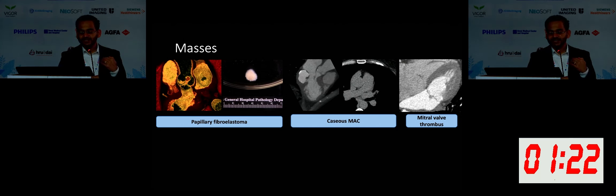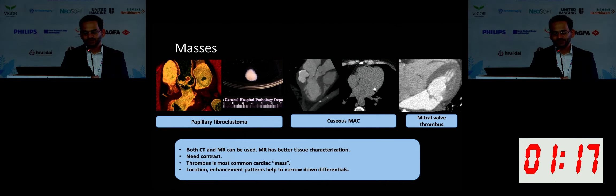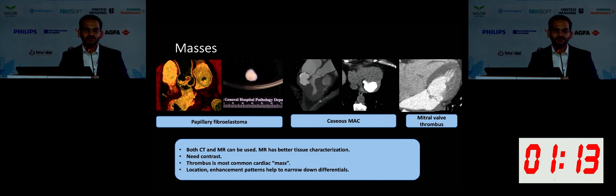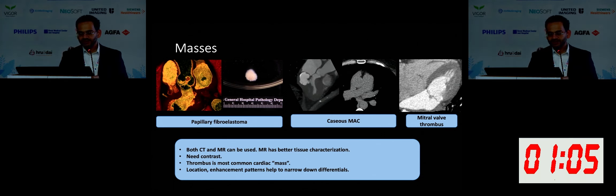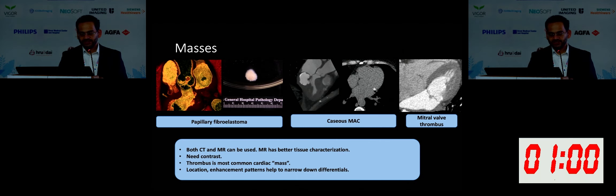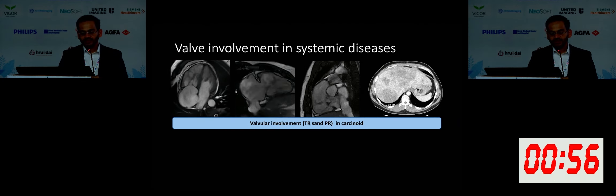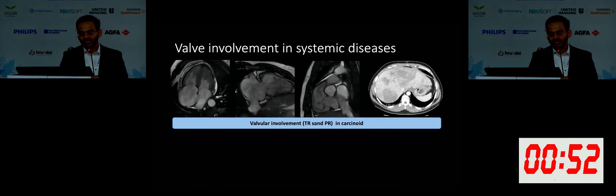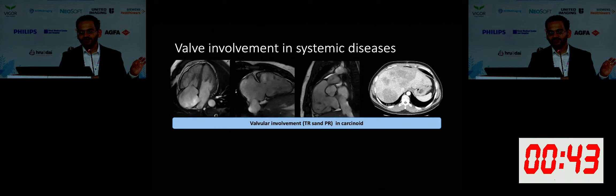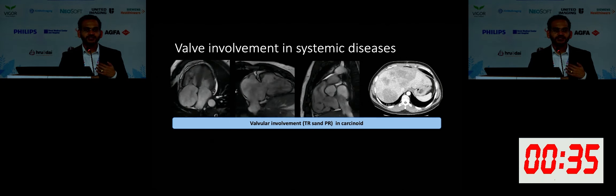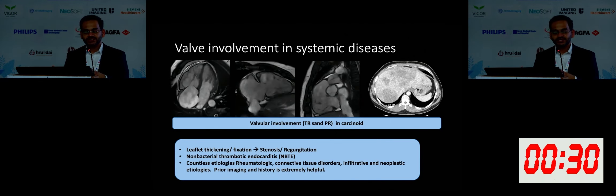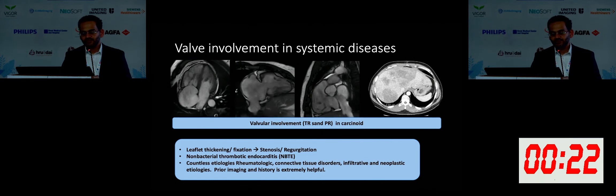Thrombi are exceedingly common. Please note that the most common cardiac mass is actually thrombus. Make sure you have evaluated the possibility of a thrombus, particularly if the patient's ventricles are not contracting because it activates Virchow's triad. Make sure you obtain a one-minute or two-minute delayed image to assess for thrombus. Sometimes you can catch situations like this patient who has carcinoid with multiple hepatic lesions and exclusively right-sided valve involvement — tricuspid regurgitation and pulmonic regurgitation. History and prior imaging are the two most important things for you to pick up the anomalies.